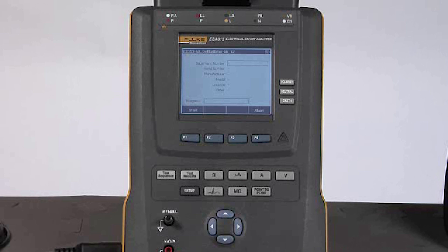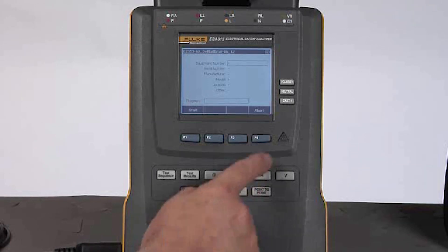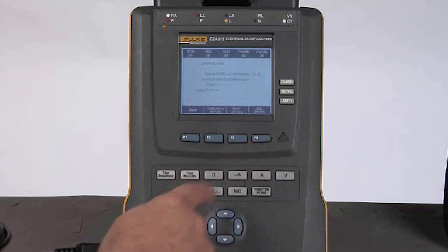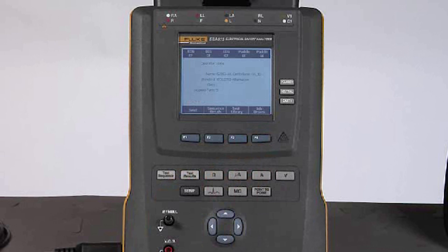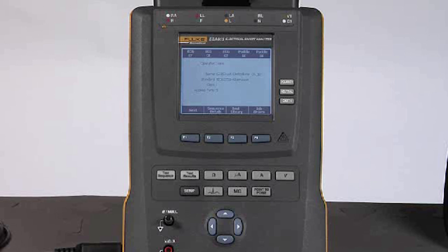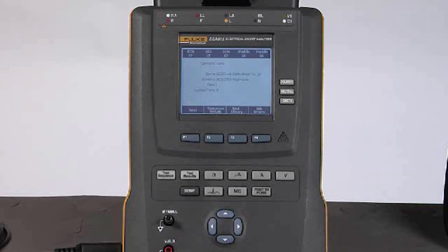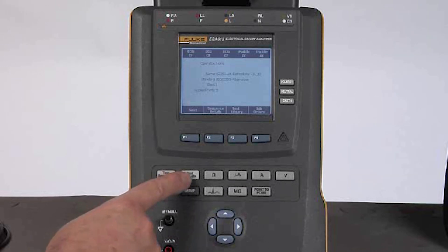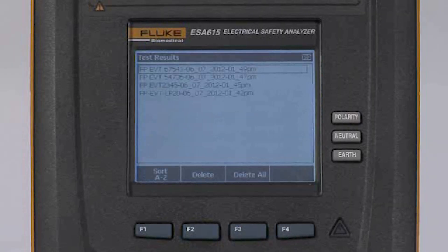We'll leave that for now. The job orders button F4 is for future use. What if I want to review the test results from tests that I have run during the day today, during this last week, or however long? I will pick the test results button and it will list all of the test results that have been stored in onboard memory on ESA 615.